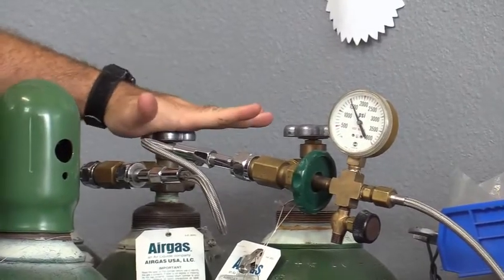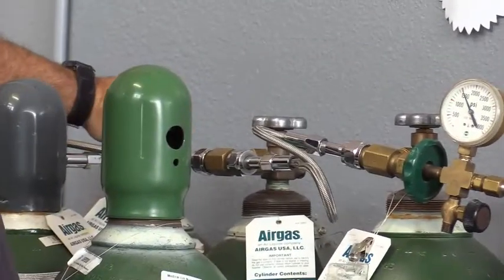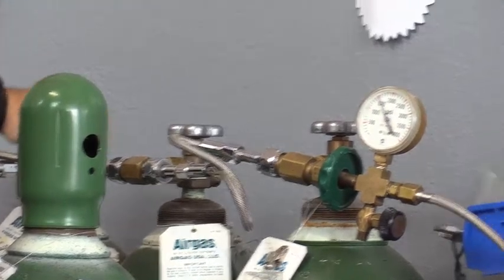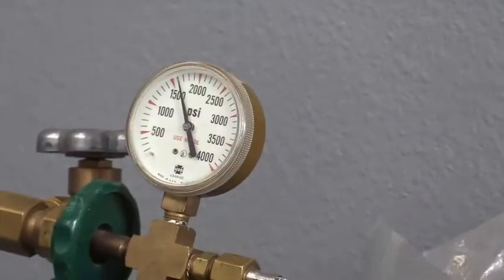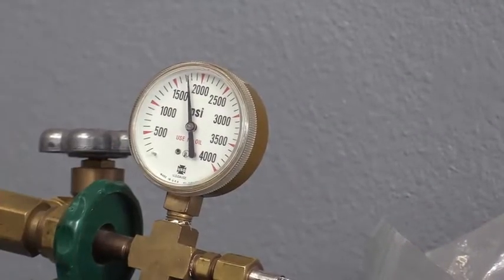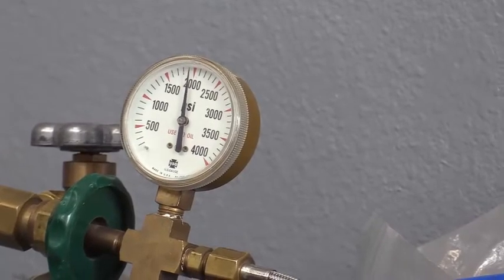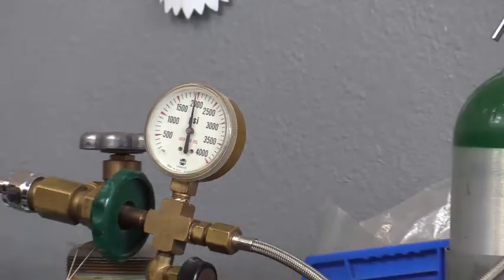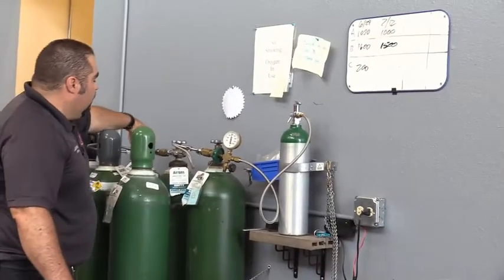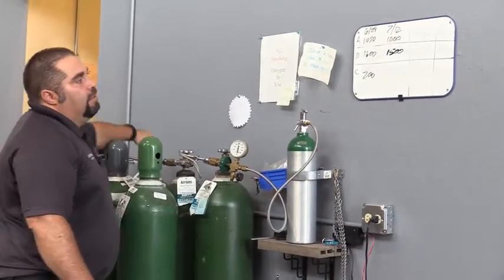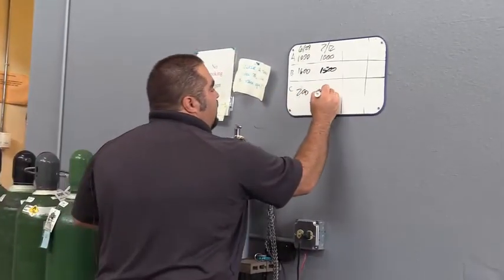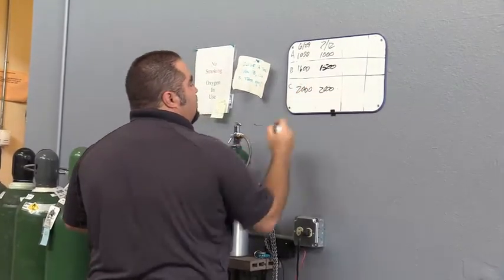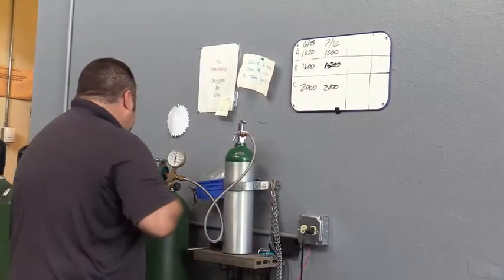And we're going to shut that down. So once again, make sure we shut down B before we open up C. So now we're going to open up C. And you can see the needles move and we're going to go up to about 2,000 here. A brand new tank is at 2,000. So C is pretty much a brand new tank. Then we're going to shut down C. I'm going to write the 2,000 up here. We'll add an extra zero right there.